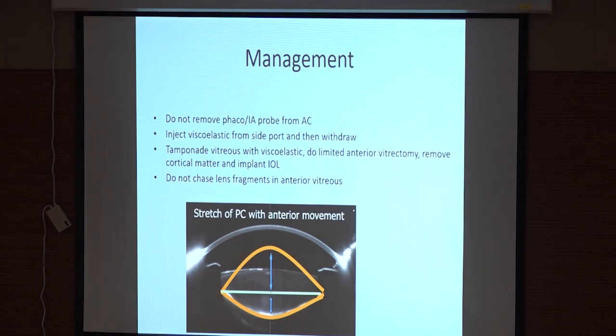Very important, this last line is extremely important. Going behind the level of the posterior capsule is an absolute no-no for an anterior segment surgeon or a cataract surgeon. You don't want to put a wire vectis into the vitreous cavity to remove fragments. You don't want to put the phacoprobe in the mid-vitreous cavity trying to emulsify. That's an absolute no-no. So all that you are allowed to do is an anterior vitrectomy, remaining mostly up to the pupil or the anterior capsule level. Don't go beyond that.